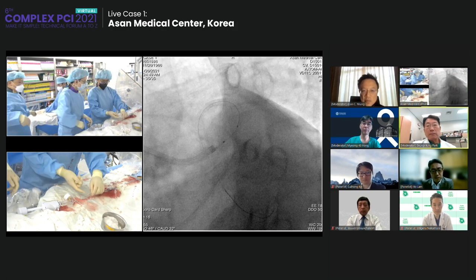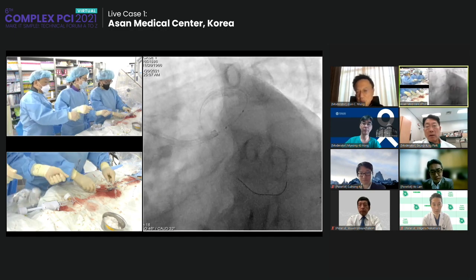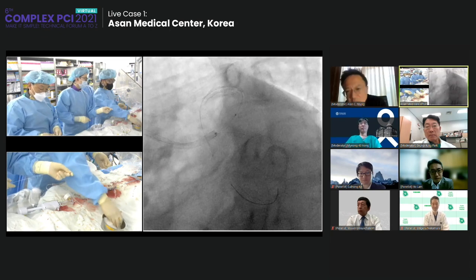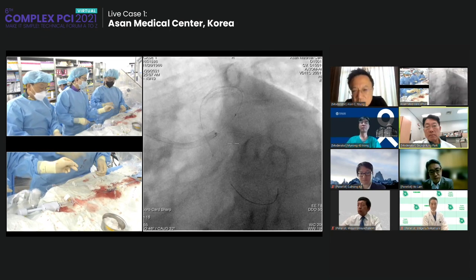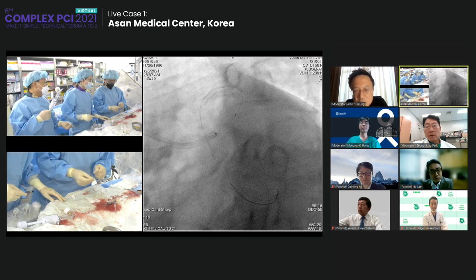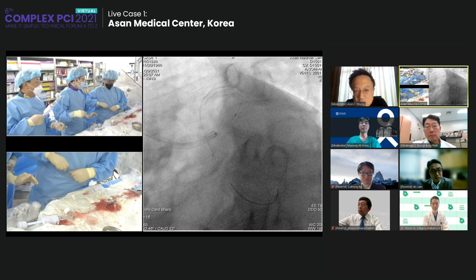3.0, yeah, 3.0. Right. And sometimes wire passage is very difficult. Also, the configuration is not good. This is some not DK crush. This is our invented technique. So we tried it in several cases. We had a nice result, and the wiring is very easy.